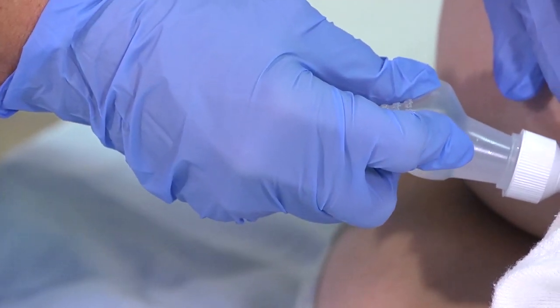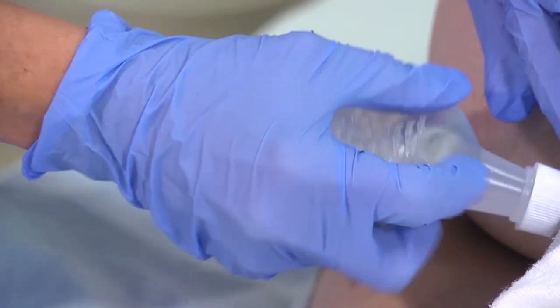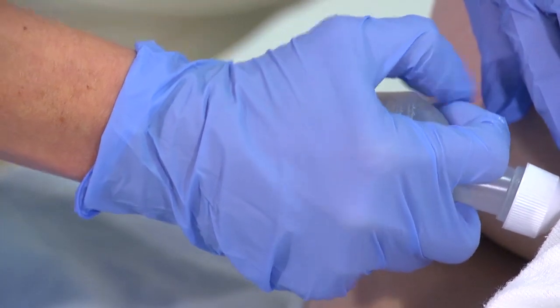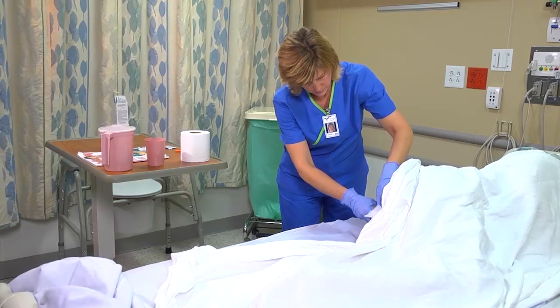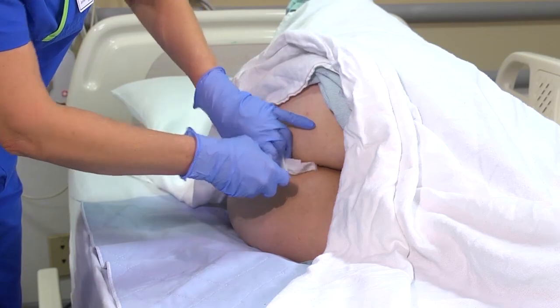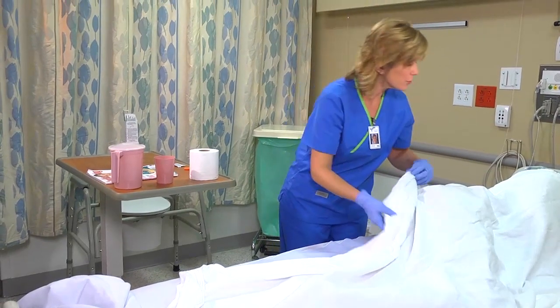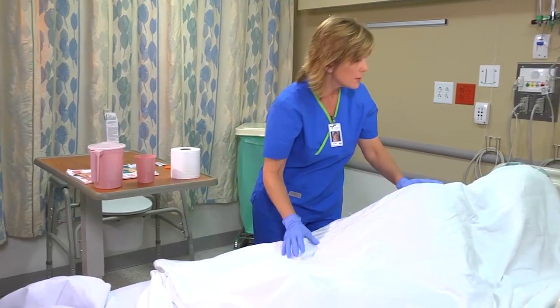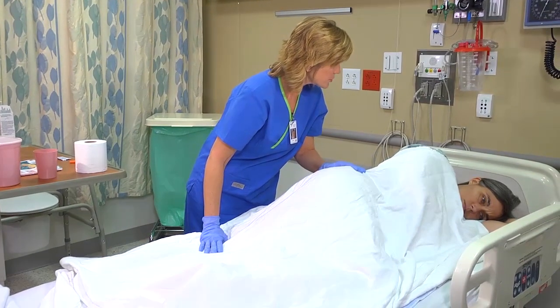Once you've inserted the lubricated tip to the proper depth, roll the plastic bottle from the bottom to the tip until all the solution has been instilled into the patient's rectum and colon. When you're finished, press a few layers of toilet tissue around the rectal tube at the anus and gently withdraw the tube and tip. Discard the enema container in the proper receptacle. Instruct the patient to retain the solution until she has the urge to defecate, which usually occurs in 2 to 5 minutes.